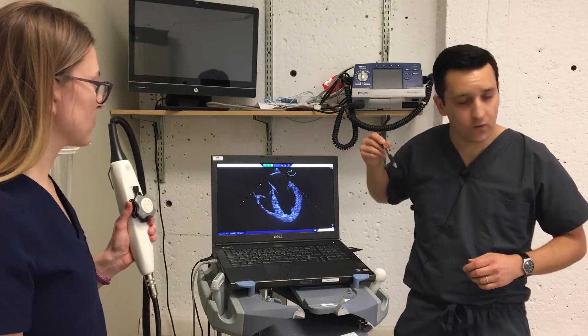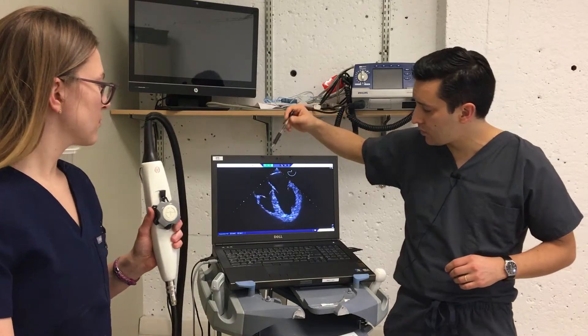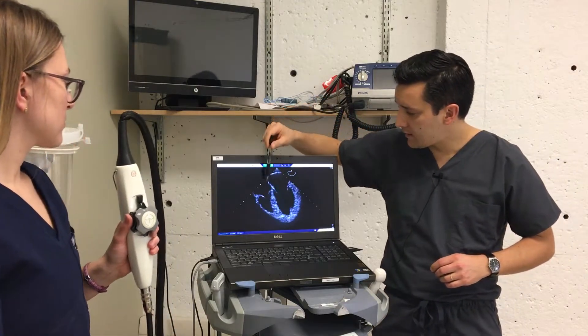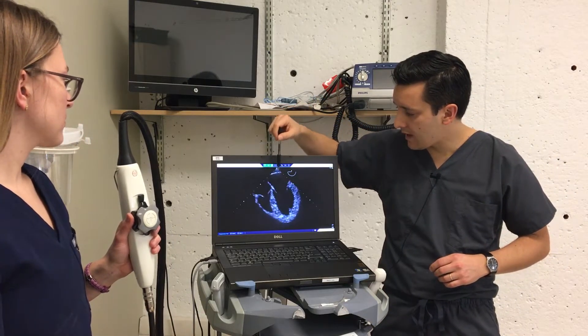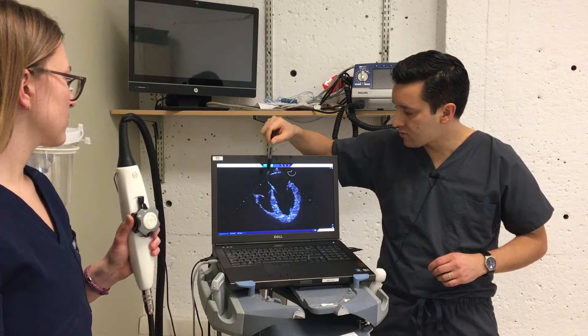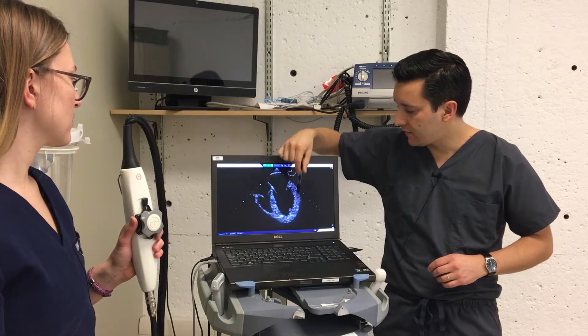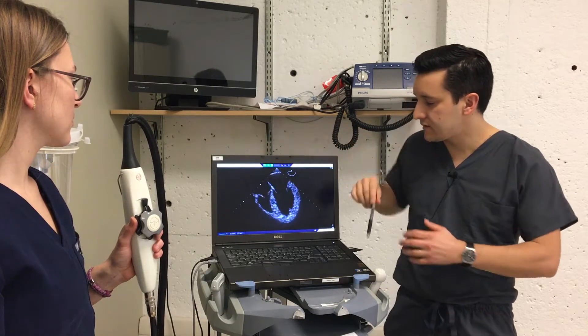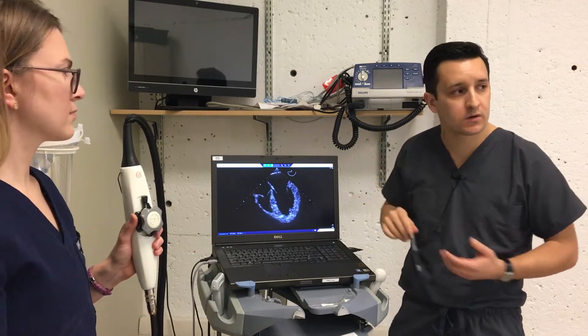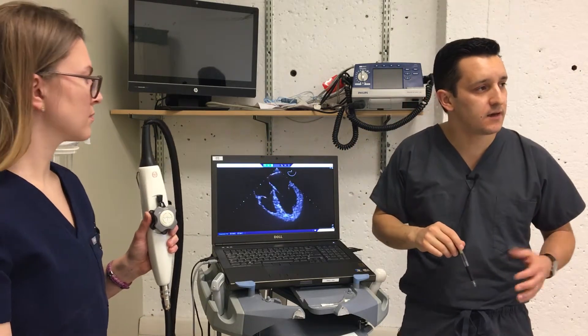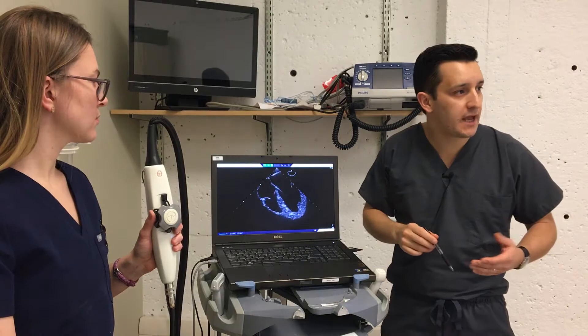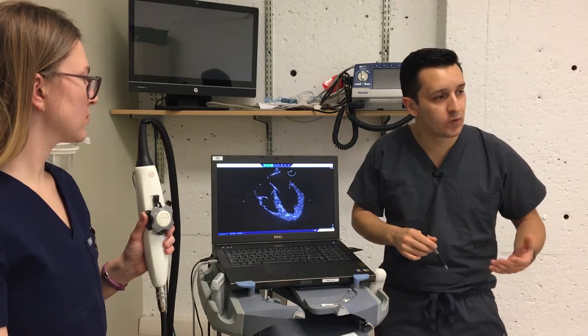This is our home-base view in the four-view protocol. As you can see here, we have the left atrium, right atrium, right ventricle, and left ventricle. This is similar to our transthoracic four-chamber view — the apical four-chamber view.